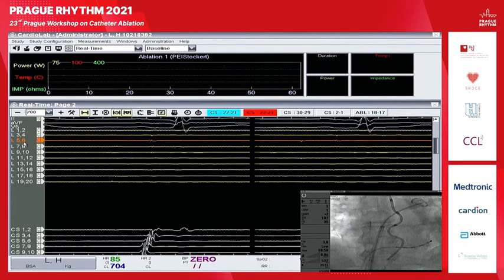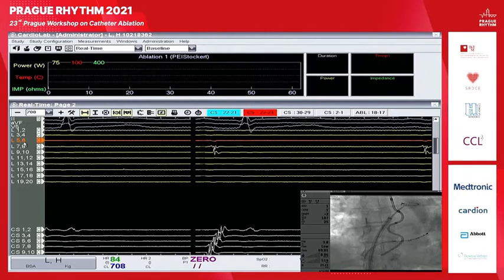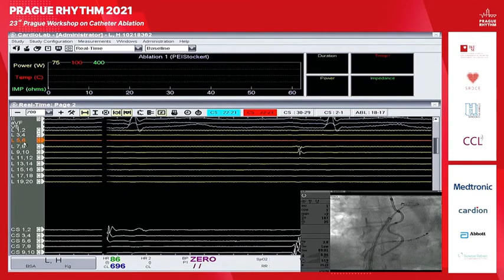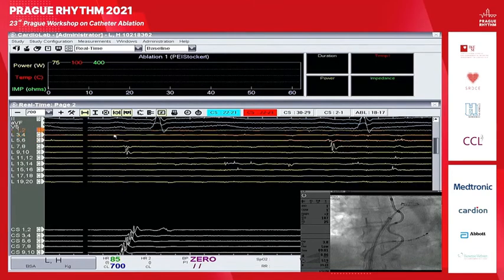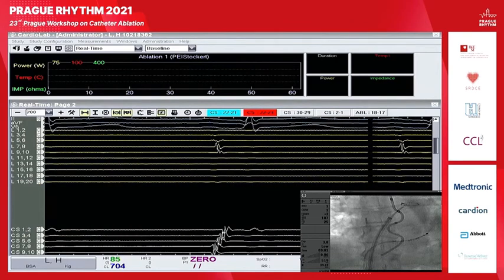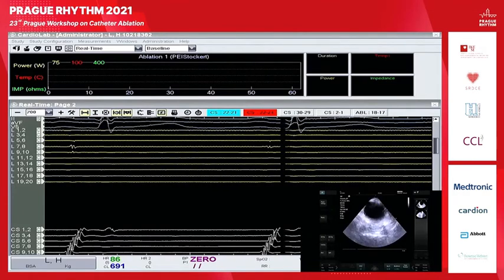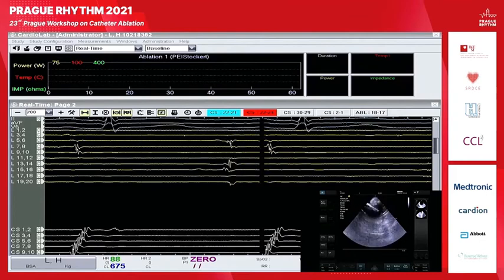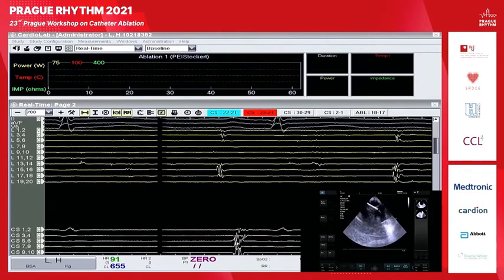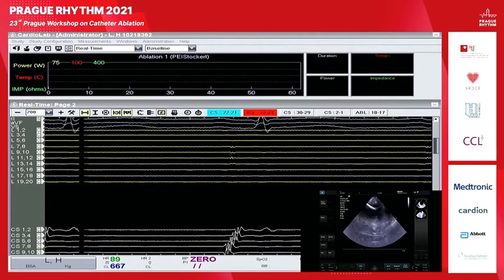So now Honza is in left superior vein, which is clearly visible on the far field. So actually, can they show even like eyes or not? I don't know. It's maybe this. Actually, just to visualize how far we are, or how inside or outside we are in terms of the level of isolation. Because when we remap all this laser Excalibur or X3 patients, so we were so amazed how far we are in terms of the level of isolation.